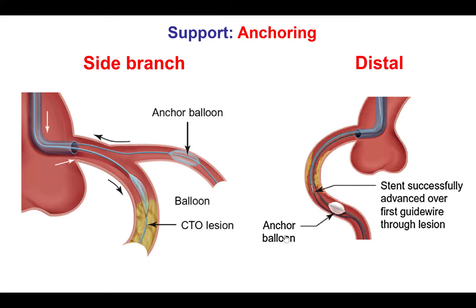We then thought that if we delivered an angiosculpt balloon, we could possibly dilate that lesion, and we attempted what's called the distal anchoring technique. Distal anchoring is extremely useful in these complex cases of delivery through calcium and tortuosity, and can be done by advancing two wires through the coronary artery. One balloon is advanced over one of the wires, the balloon is inflated distally, pinning the other wire against the wall of the vessel, providing good support for advancing balloons and stents over the second trapped or anchored guide wire.